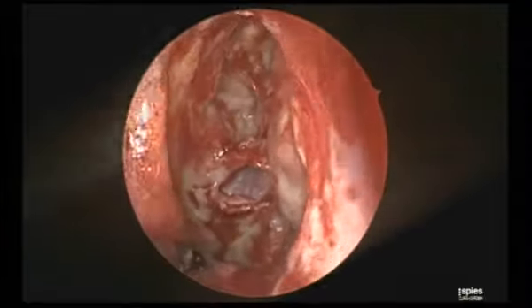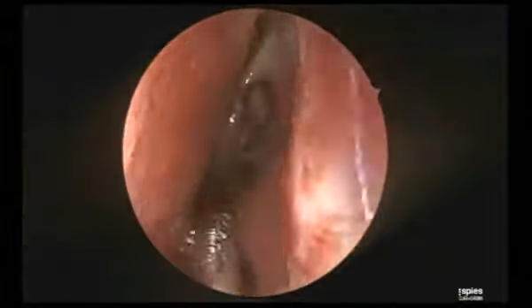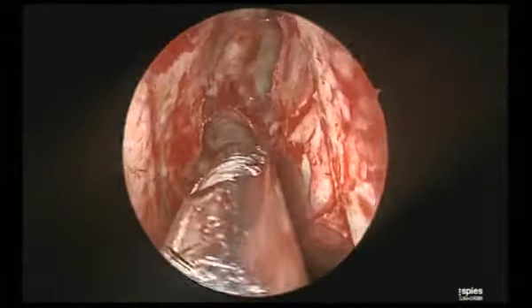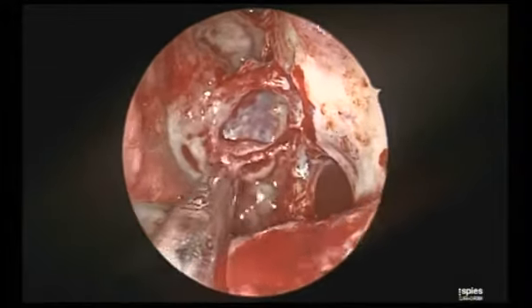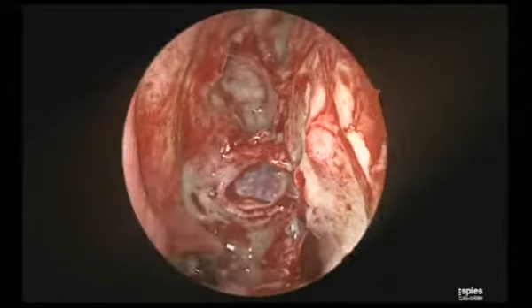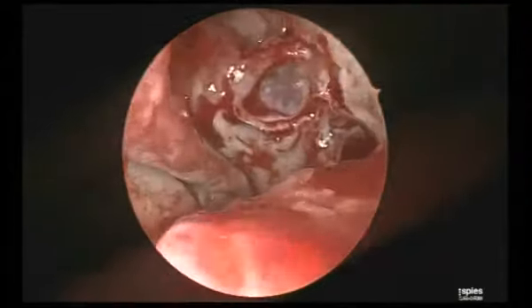But there can be many cells between that and the artery, or is there only one cell? One cell, sometimes two cells, sometimes a huge supraorbital cell, sometimes there is hardly any cell and the artery is immediately behind the frontal recess. That can be variable. No, I'm asking about the relationship to the ground lamella. So you're saying the superior attachment of the ground lamella.